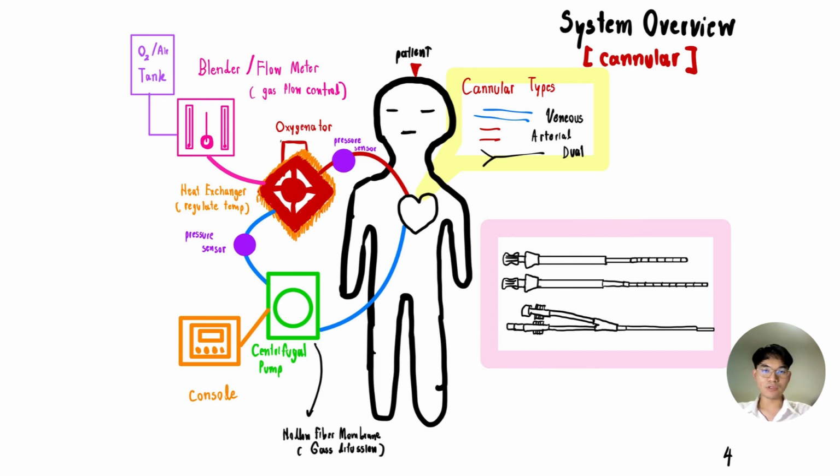The cannulae are special tubes used to transmit and receive the blood from the patient. They vary based on the operational area, with venous cannulae being longer to accommodate the distance they must cover, and arterial cannulae being shorter, and each type is robustly reinforced to prevent structural failure.